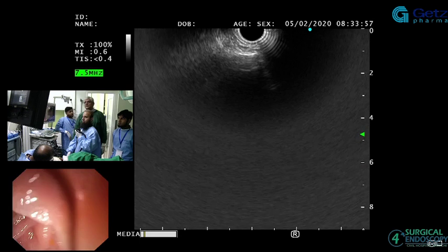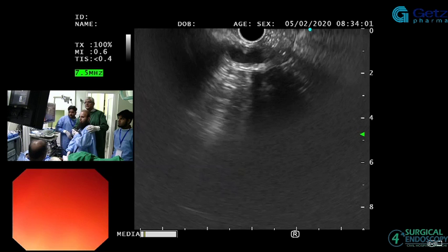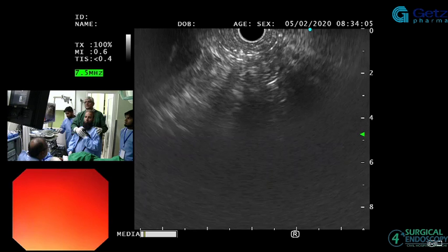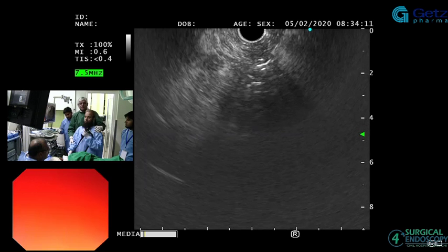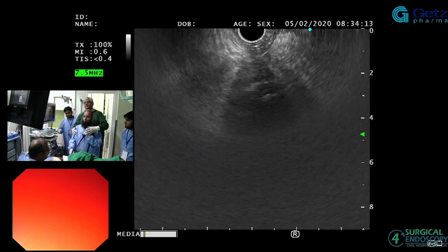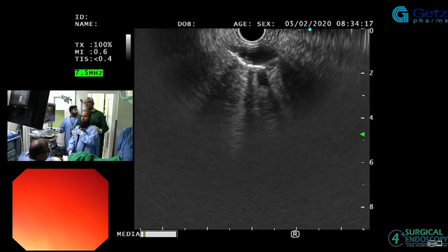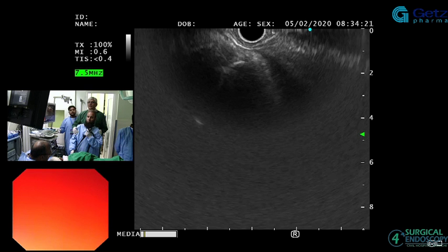When you rotate, you'll see something here. So we saw one vascular structure come and go, right? If we do this, just straight, you've got the aorta there, go more and, right, you see, this is the IVC.